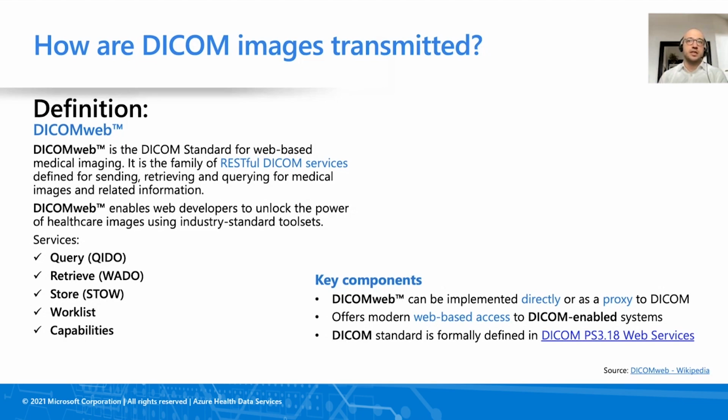And also I would like to say that only 5% of DICOM assets are in DICOM Web, but that percent of adoption is exponentially increasing as a lot of institutions, research centers, and private clinics are moving into the cloud for easy access of the images. Because until recently, DICOM has been a modality that principally lived in the data center.